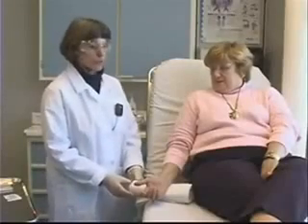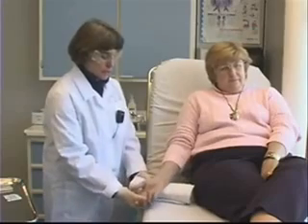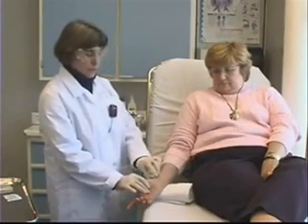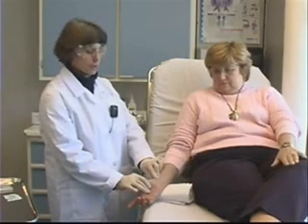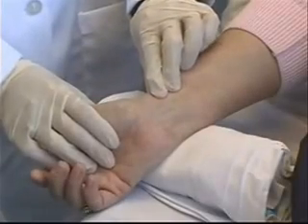I now have my patient seated comfortably on the stretcher. I'm going to tuck a rolled-up towel underneath her wrist, which will help hyperextend the wrist a little bit. This will bring the artery a little closer to the surface and make it easier for me to palpate that artery. I'm going to feel for the artery again — there it is.